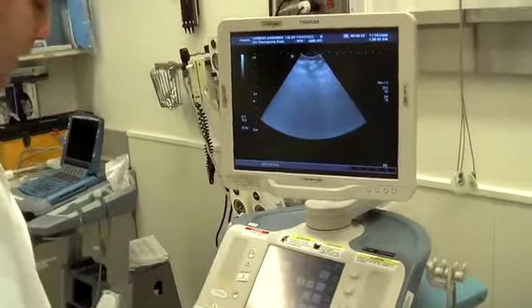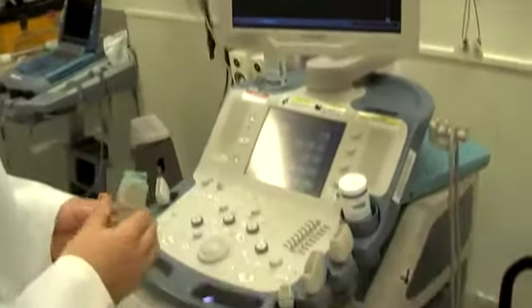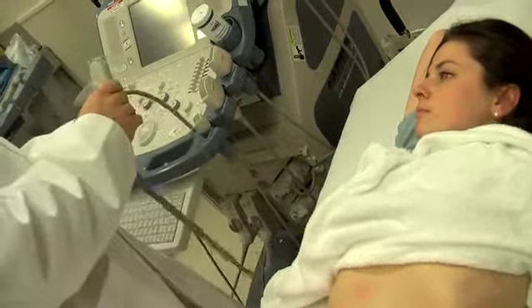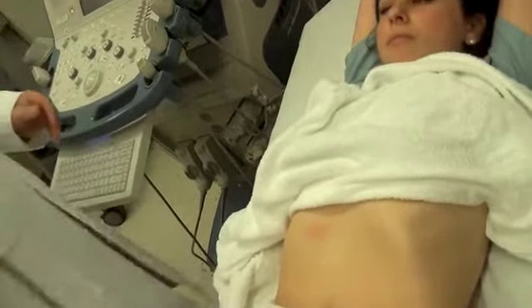The next view in the FAST scan is the left upper quadrant view, or the splenorenal view. This can be a little bit more difficult to acquire. Wherever you found the right upper quadrant view, keep in mind that the liver kind of pushes everything down on the right. So when you get the left upper quadrant view, the kidney tends to be a little bit higher and a little bit more posterior. So just go a little bit higher and more posterior than where you found Morrison's pouch on the right.